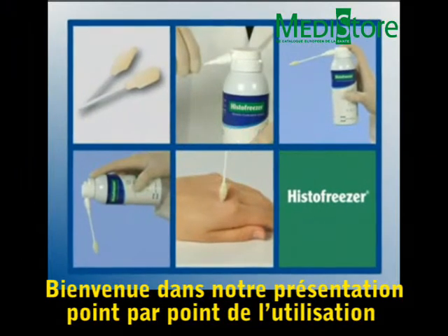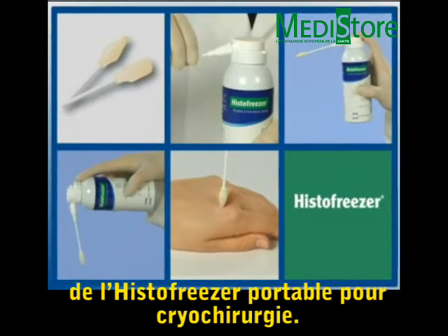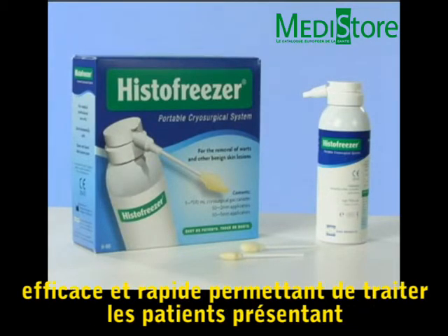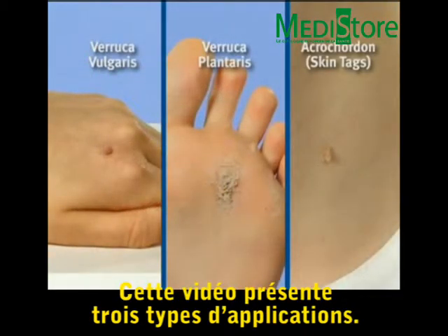Welcome to an overview of the step-by-step basic operating procedure of the HistoFreezer Portable Cryosurgical System. HistoFreezer is an easy-to-use, effective and quick in-office portable cryosurgical system to treat patients with common warts and benign lesions. It is for use by medical professionals only. This video demonstrates three common patient presentations.